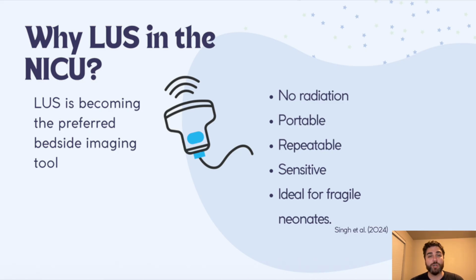For premature infants and critically ill infants, who may require multiple daily assessments, this makes lung ultrasound a great bedside tool in comparison to the chest x-ray because it provides immediate real-time information that is available to the clinicians, and with that information clinicians can quickly start respiratory support and tailor it with much more precision than they can with just a normal x-ray.